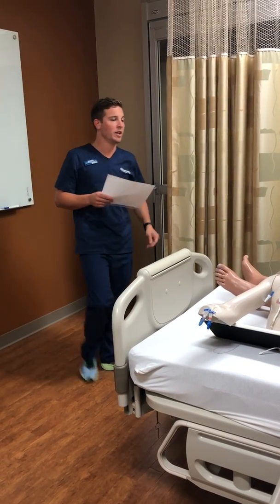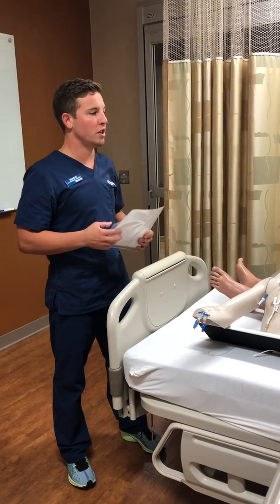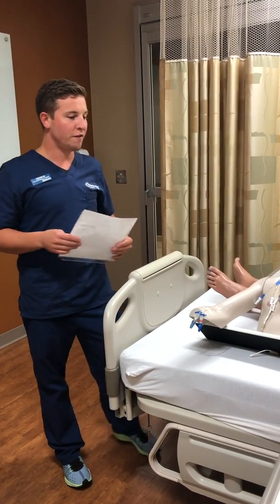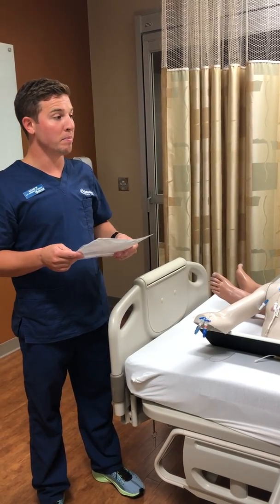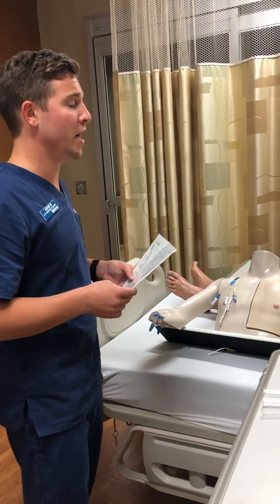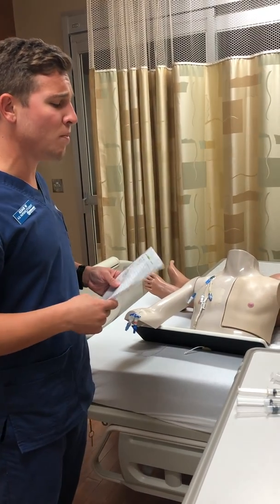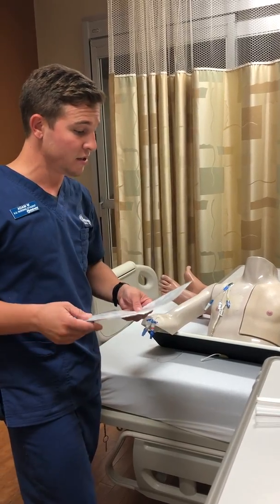Good morning, Jennifer. My name is Adam. I'll be your student nurse today. We had an order here to collect some blood for labs here. We have a CBC, a complete blood count, and a basic metabolic panel, which is electrolyte count. Do you know what these are? And she says that she does.